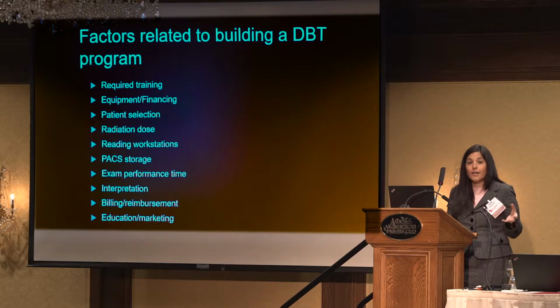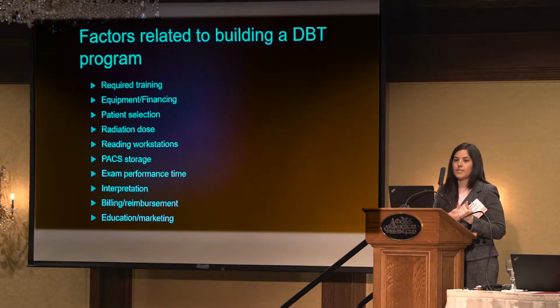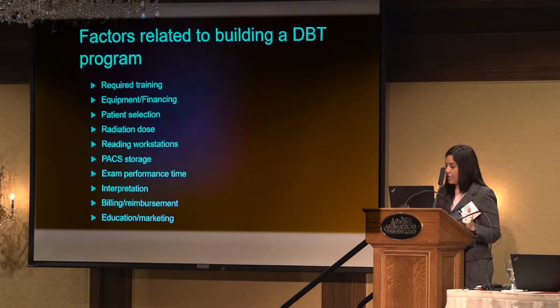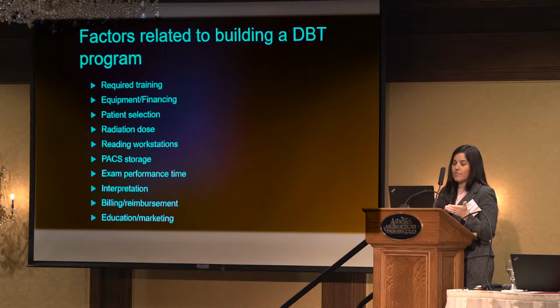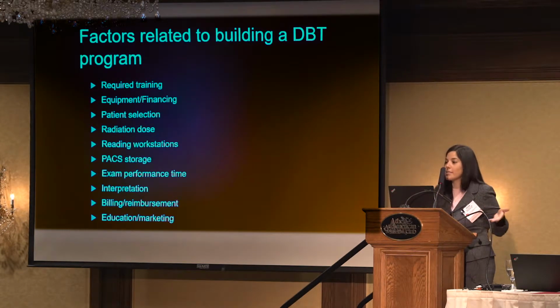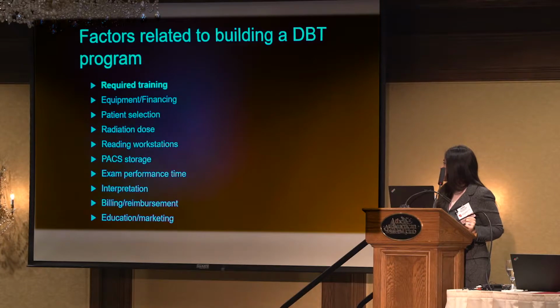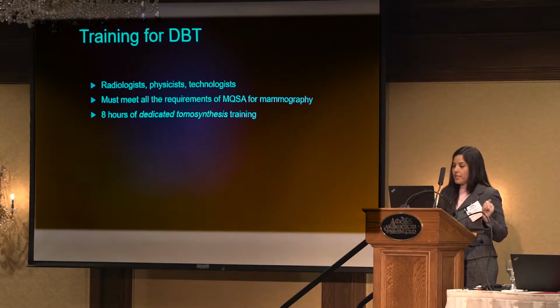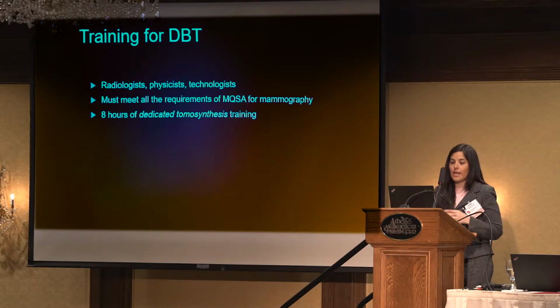Even if you've already got tomosynthesis at your institution, these issues are not one and done issues. They often need to be revisited as you're working through your implementation. Again, in the interest of time, I'm not going to talk about every single one of these, but we will spend several minutes touching on the basics of things to consider in these topics. So required training: there is a new modality training requirement which applies to all mammography personnel, anybody who's going to be involved, radiologists, physicists, technologists.